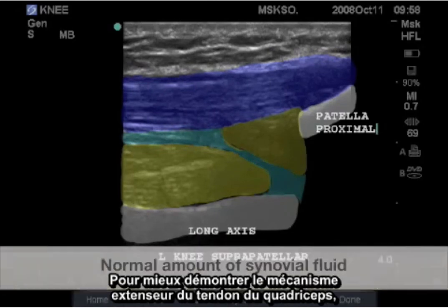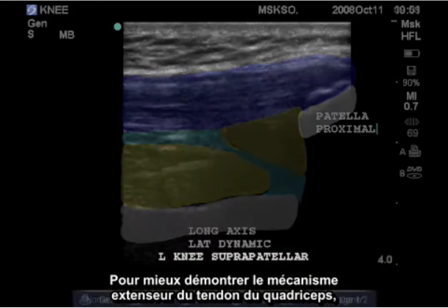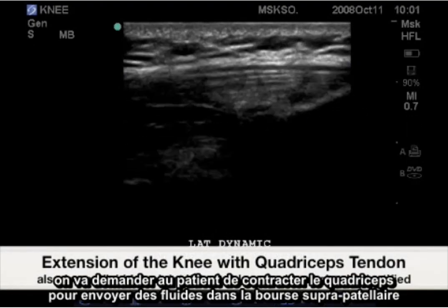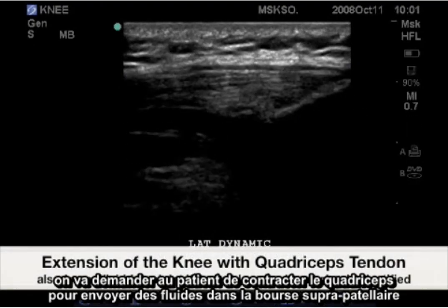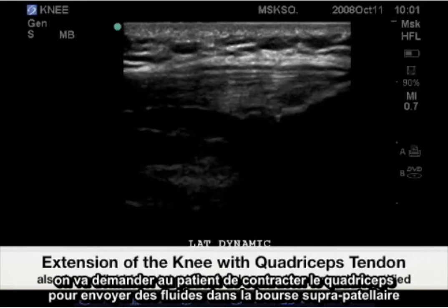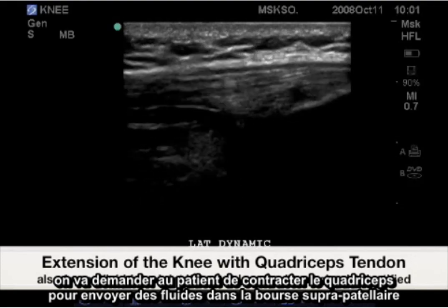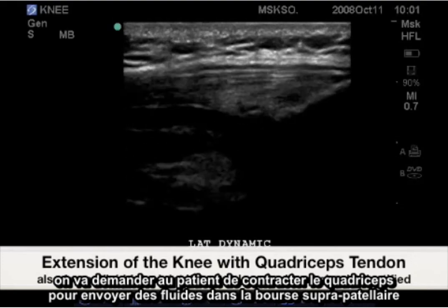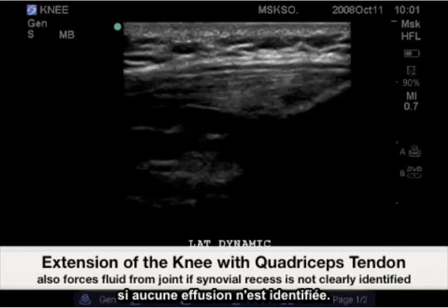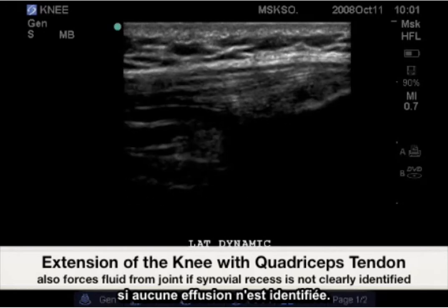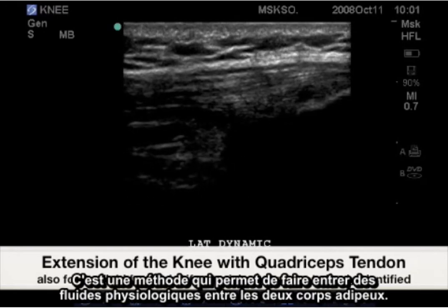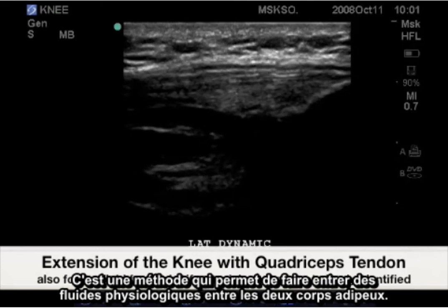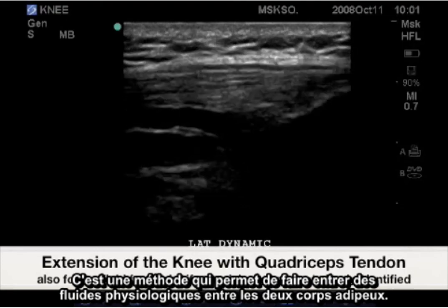To further demonstrate the extensor mechanism of the quadriceps tendon, having the patient tighten their quad will also force fluid into the suprapatellar recess. If no joint effusion is identified, this is one way to bring out normal physiologic fluid between the two fat pads.